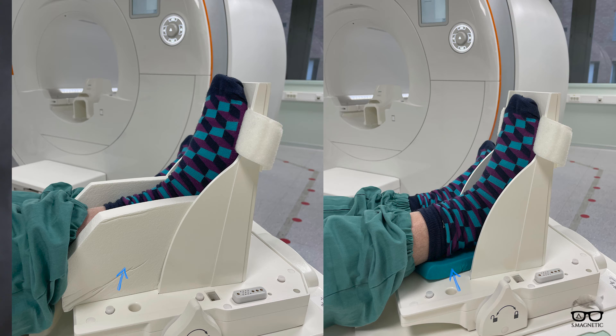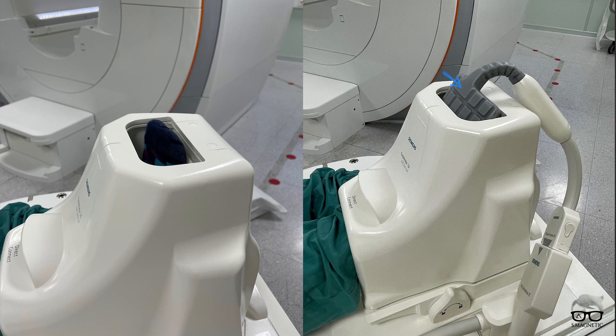Like I mentioned, I'm pretty sure there are many ways to get around this, but just recently I figured out that if you have a very long foot, you can use a different pillow to get the foot a little bit lower, but sometimes it just doesn't cut it because the foot is just too long. If the foot is outside the coil, you won't get any signal. So the way I get around this is by using the four-channel special purpose coil, placing it inside the forefoot, giving full coverage from the ankle to the forefoot — the whole foot. Without further ado, let's go to the scanner and I will show you some images.